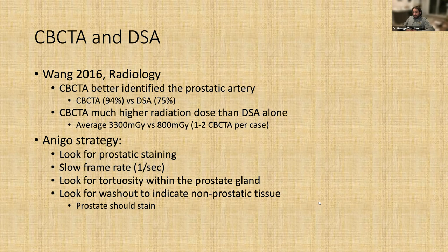I think it's harder to get the granular anatomy of the prostate arteries on the cone beam CT, is what I'm trying to say. Because the more distal you are, the better your results of your CT and the more information you can get from it. So that's why I like a CTA.